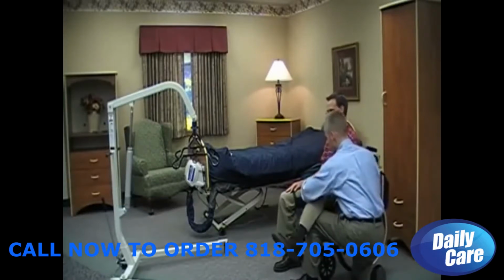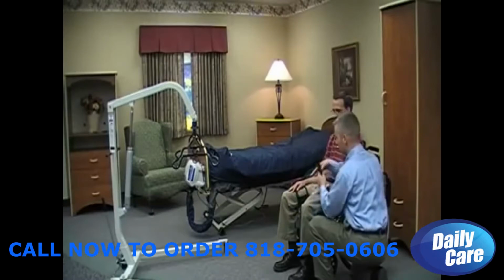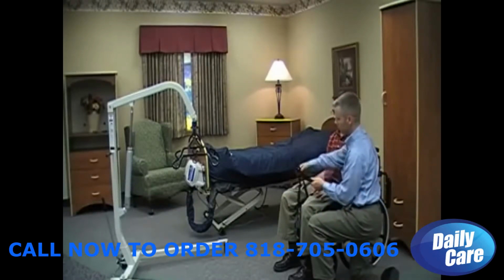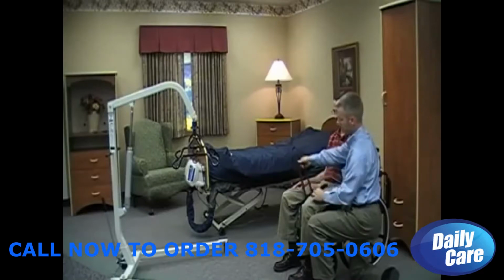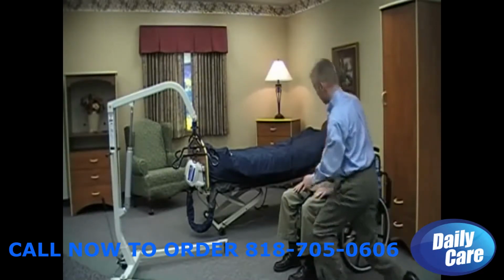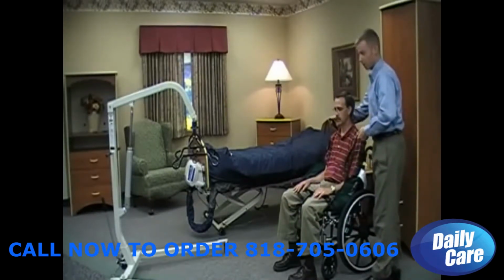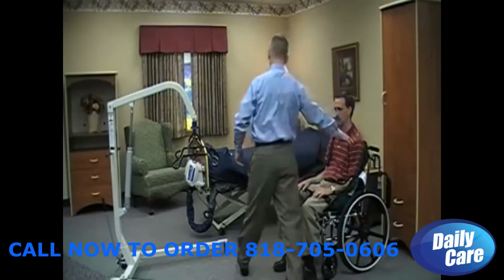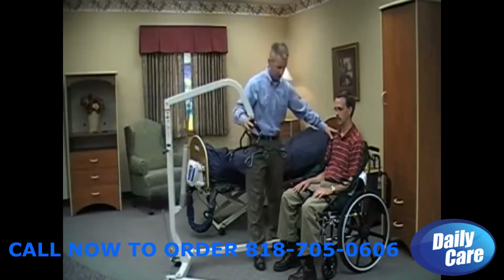I'm going to use the edge of my hand to ensure that it's moving through without friction, place their leg back, and then from here I'm going to take these two leg straps and I'm going to cross one through the other, in this instance left through right, and draw them down snugly. That's to ensure proper fit for resident safety. I'm also going to make sure that both of my shoulder straps are accessible, and then I'm going to bring my sling up, my lifter up to the resident.